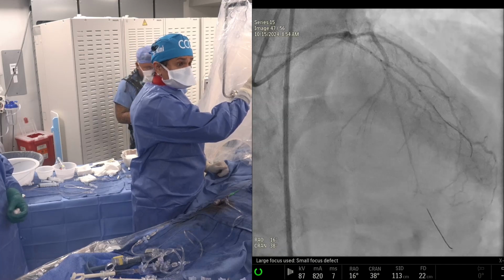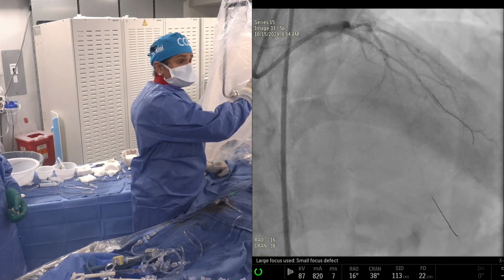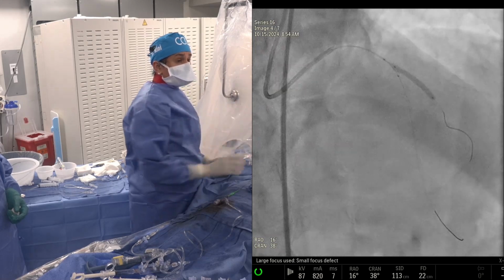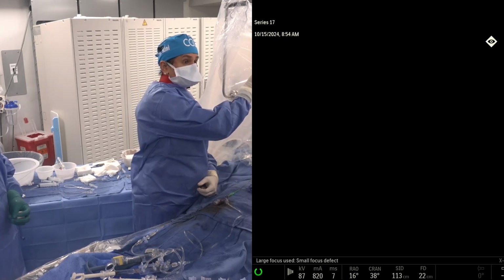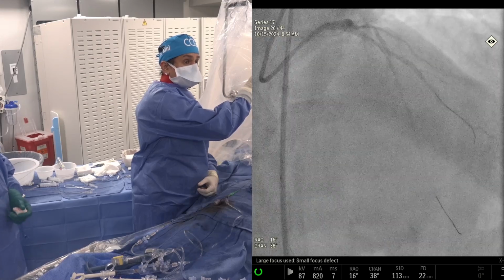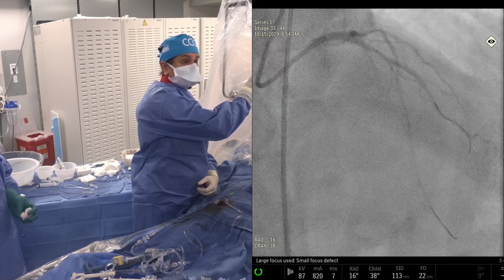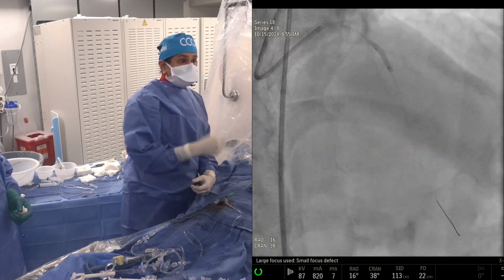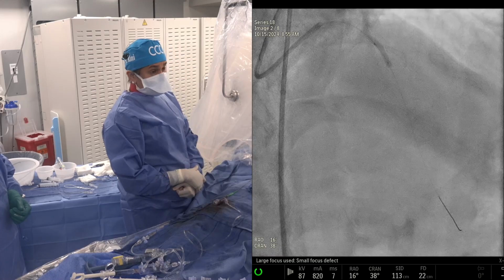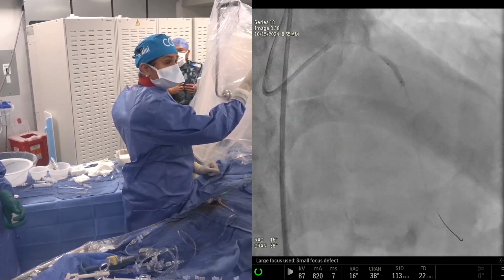Okay, so this is where we are. So you place the side branch stent. This was at 14 atmospheres. You take out, you check that everything is okay. Again, this is fluoro-save, we don't go on full cine. You remove the wire, and this is where you are. You crush that stent. This was 2.5. We went to 20 atmospheres.